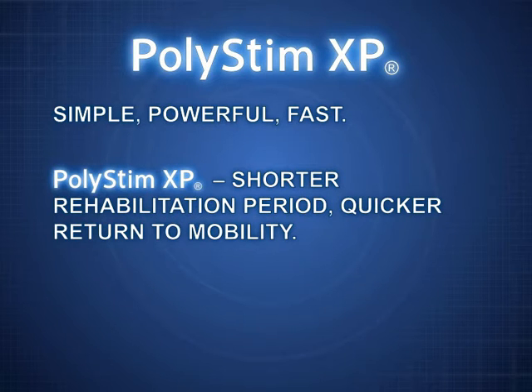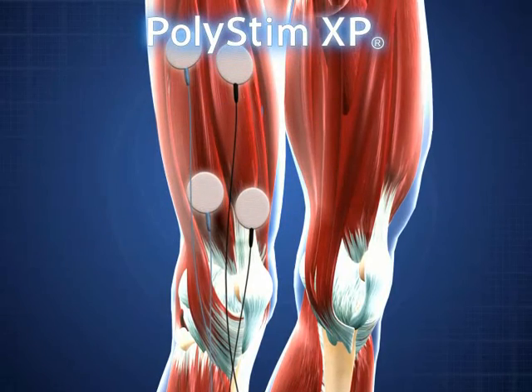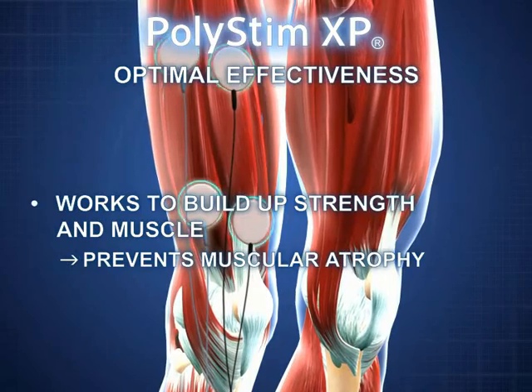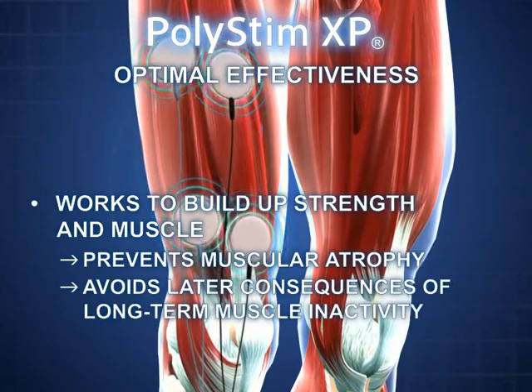Polystim XP helps patients achieve shorter rehabilitation times by effectively strengthening and rebuilding weakened or atrophied muscle tissue. NMES uses microcurrents which are delivered through the skin. These microcurrents activate muscle fibres, causing them to contract.